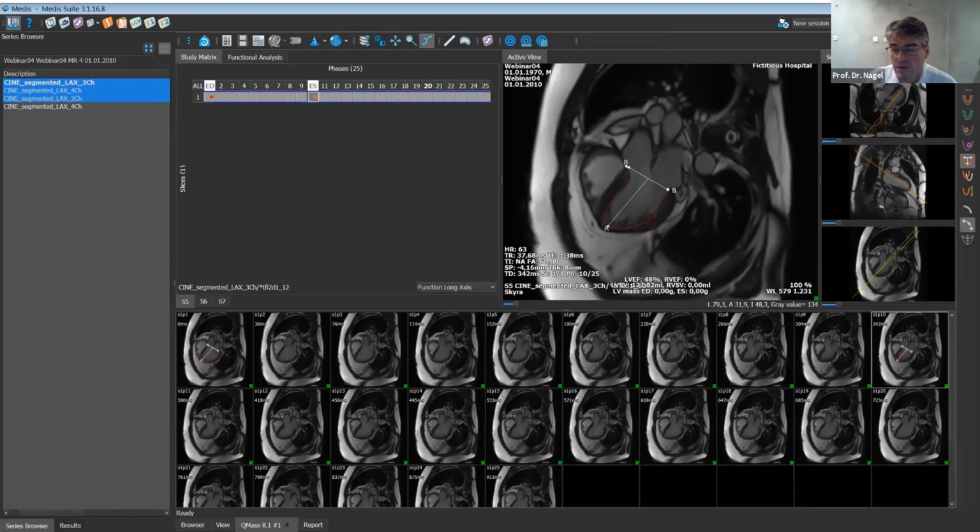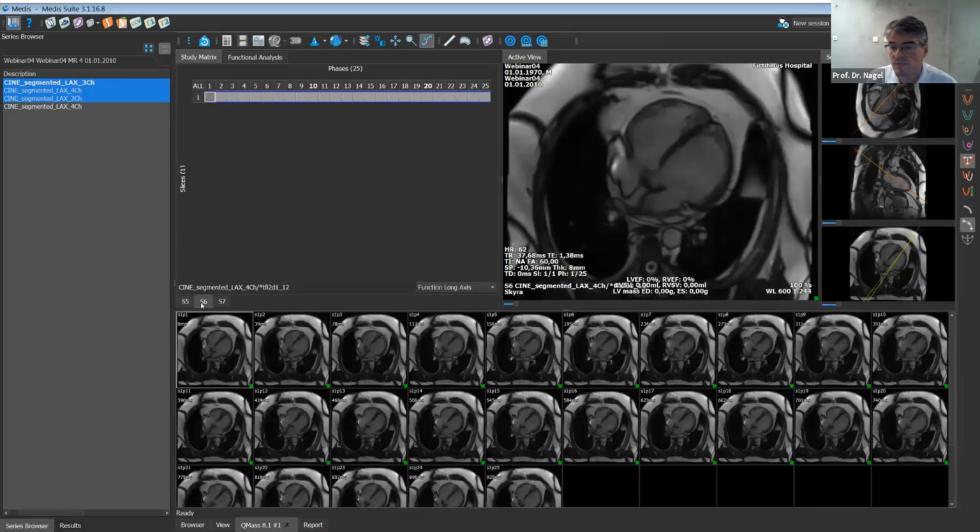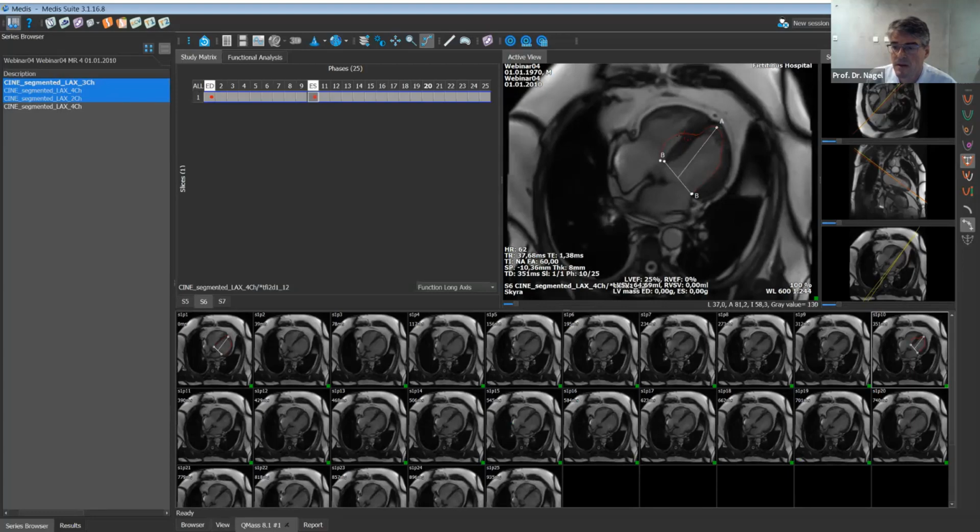It's a bit of a hypertrabeculation here. And here, okay, this one needs some correction here.